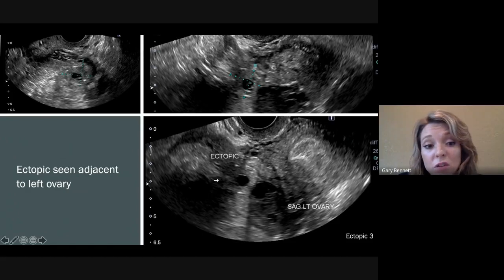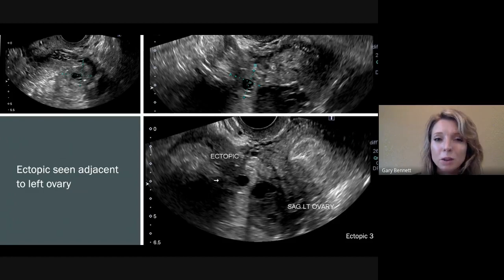I sometimes have looked for 20 minutes for an ectopic pregnancy because I am convinced that there is one. And again, that's going to be based off of the fact that the patient has an elevated HCG. They're in a lot of pain. Their endometrium has that complex-ish appearance where it's thick, but it just has kind of a fluid lining instead of having a gestational sac.